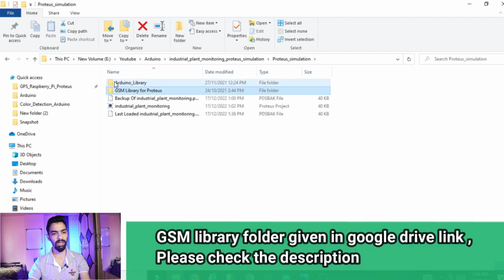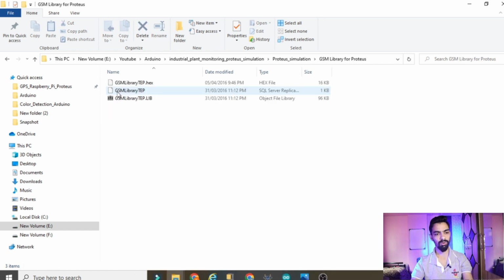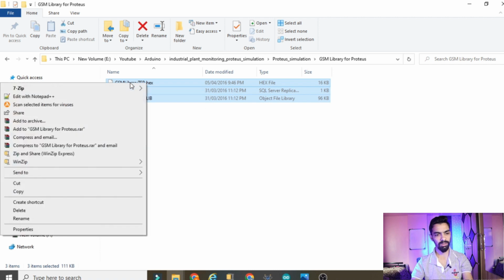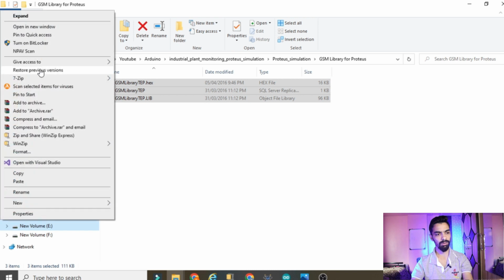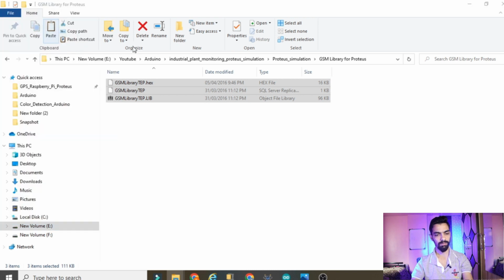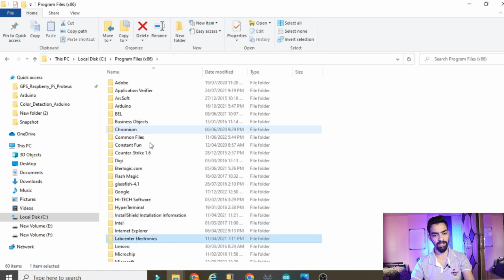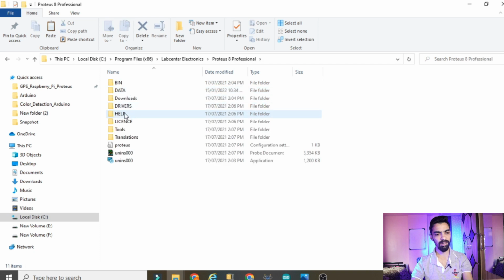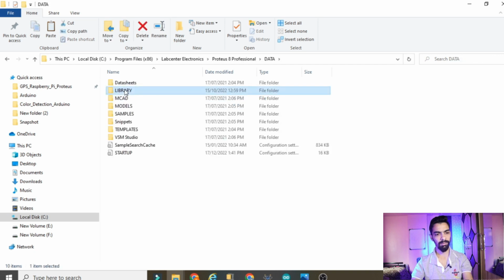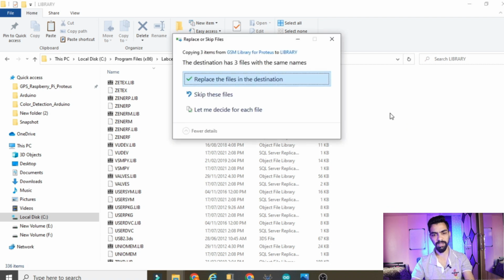So how to install that library on your laptop I will tell you. Just go to this GSM library folder. Again you can see there are 3 files, so you need to copy the three files. So copy the 3 files, then go to your C drive, then Program Files (x86), then Labcenter Electronics, then Proteus 8, then data, then library, and here just paste whatever library files we copied.